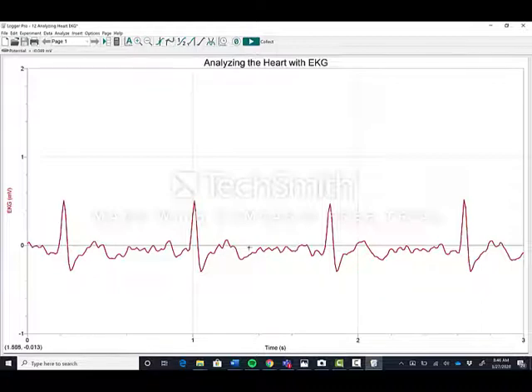So this is the time from the bottom of the T down here, the time that it takes for another heartbeat to be initiated. So this is when your heart is doing nothing at all and blood is going to be refilling the atria to be pumped out. And then this right here would be the start of another P wave.